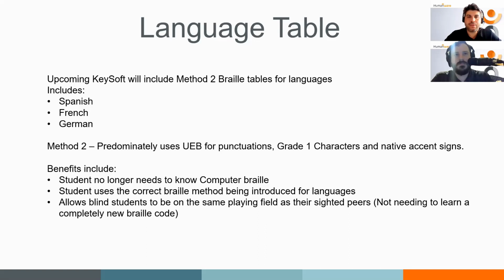Thanks very much for the webinar. When you were doing the first part and you were filling in your BRF files and you just filled in the little gaps, can you actually save as? You save the file as the student's name, so they've got that file, and then any other files that they're modifying, you can save those as. So you won't need to download any other files, as long as you make a folder with all the work that they've completed in. Probably that would be a good thing, wouldn't it?